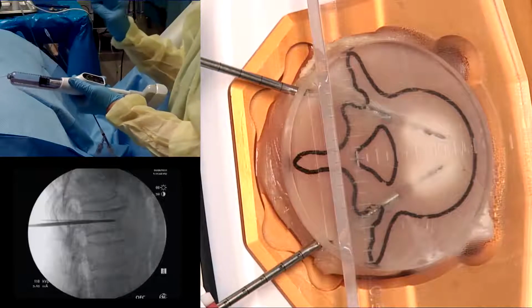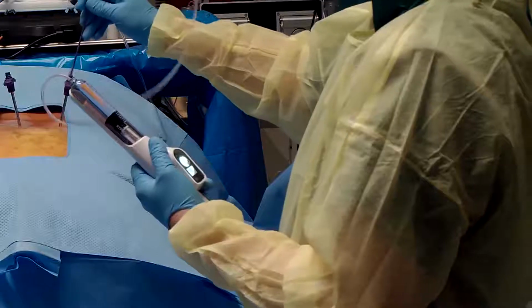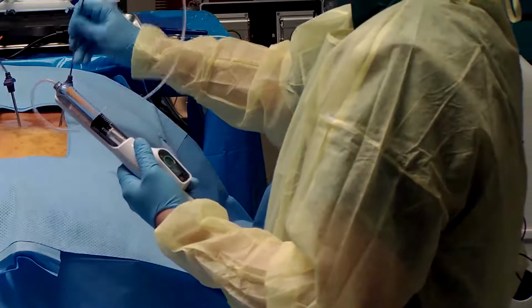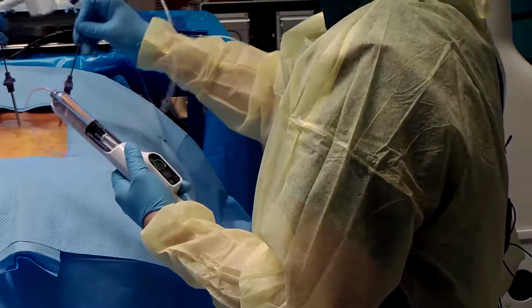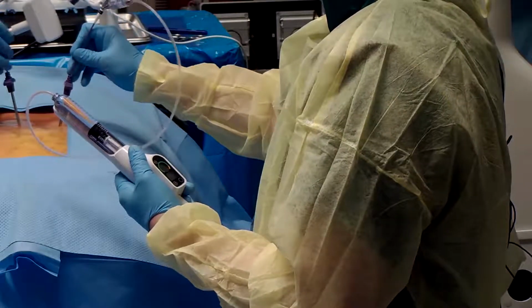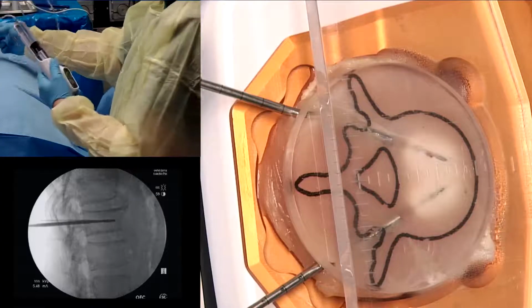So we can really guide it and get it to the point where we want to have the greatest amount of bone tamping effect. And as I mentioned previously, we want it to be in the anterior aspect of it. I'll put mine in first. So there's a little marker here showing me that I'm actually at the base of it. So I have not yet gone in.